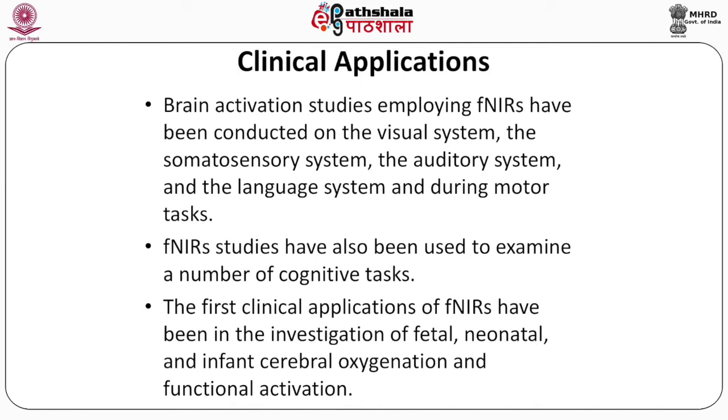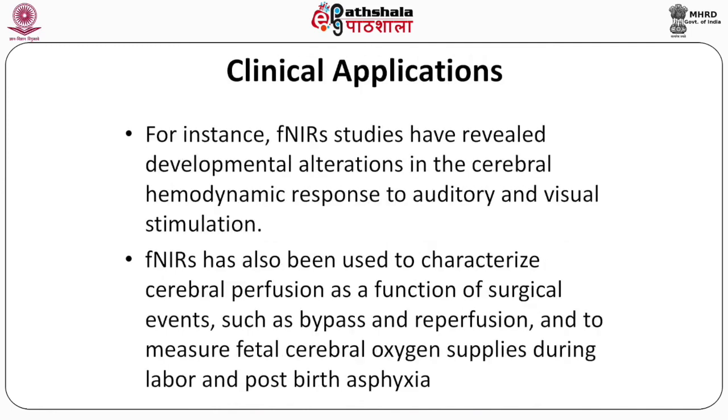The first clinical application of fNIRS has been in the investigation of fetal, as we have seen in the history, and neonatal and infant cerebral oxygenation and functional activation. So this is pretty useful, studying the cerebral oxygenation in the fetal and neonatal brain. Continuing with the clinical application, fNIRS studies have revealed developmental alterations in the cerebral hemodynamic responses to auditory and visual stimulation. Again, this is more useful in the fetus and the neonatal brains.